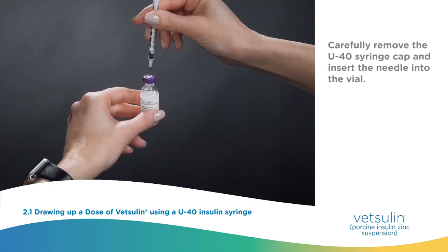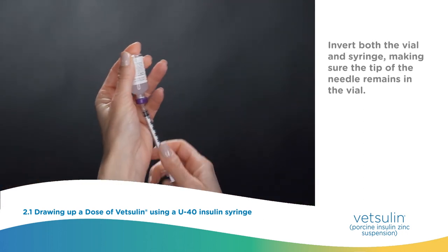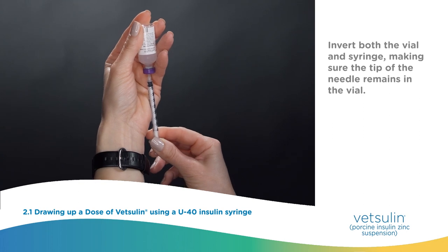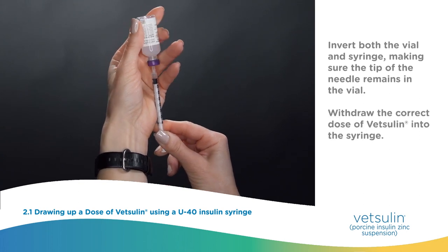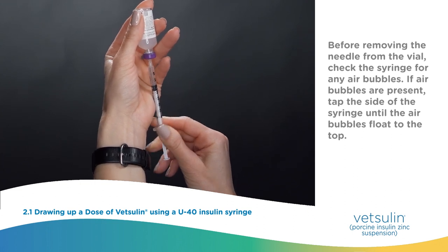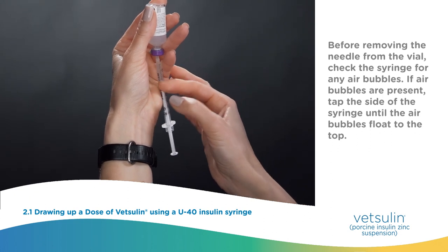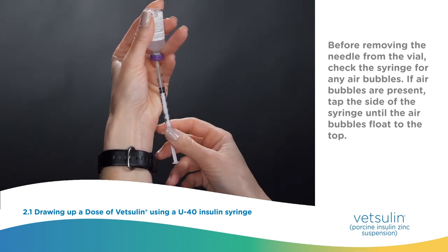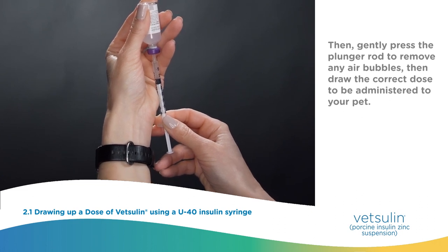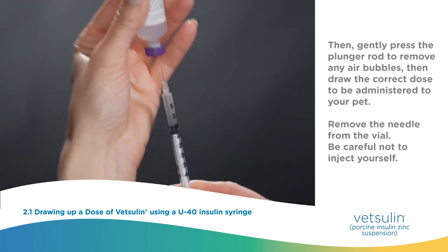Carefully remove the U40 syringe cap and insert the needle into the vial. Invert both the vial and syringe, making sure the tip of the needle remains in the vial. Withdraw the correct dose of VetSulin into the syringe. Before removing the needle from the vial, check the syringe for any air bubbles. If air bubbles are present, tap the side of the syringe until the air bubbles float to the top, then gently press the plunger rod to remove any air bubbles. Then draw the correct dose to be administered to your pet. Remove the needle from the vial.